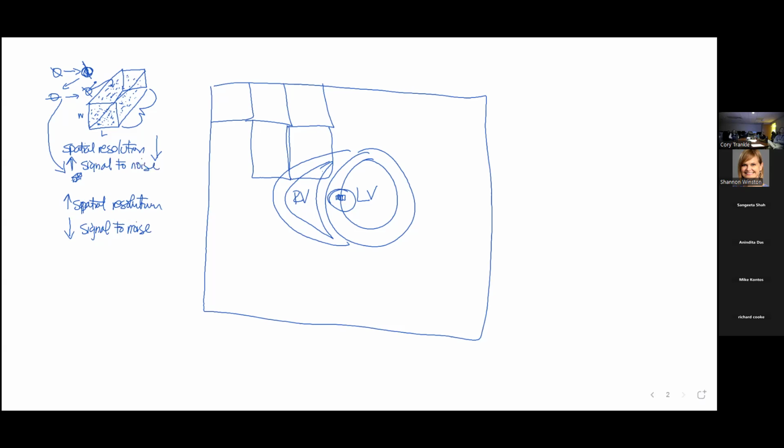Next week, we're going to talk about temporal resolution. There's three things that are always at play when you try to create the picture. Today, we're talking about just a still frame. So it's the spatial resolution.